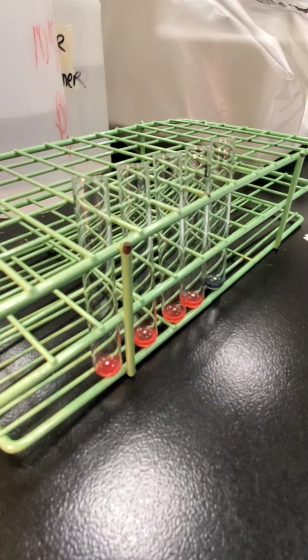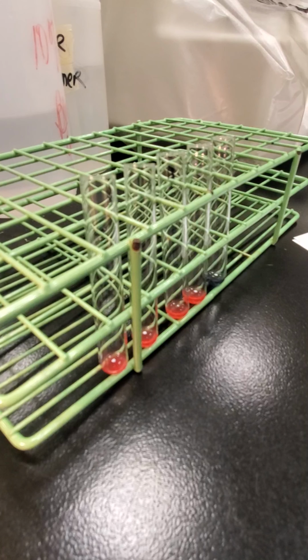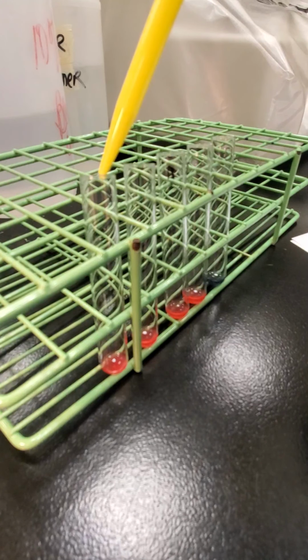So I'm going to pause the video and I'll be back in a minute. Okay, so I just pulled my tubes from the heat block. They've been incubating at 37 degrees for 15 minutes. I'm going to wash all 5 of these tubes by hand. Just as a refresher, I'll remind you how to do that. I'm going to take my saline and fill all these tubes up to the top.